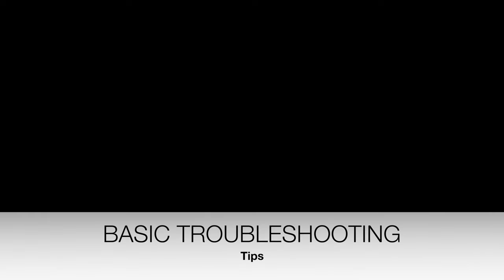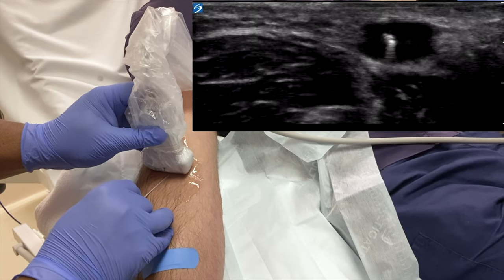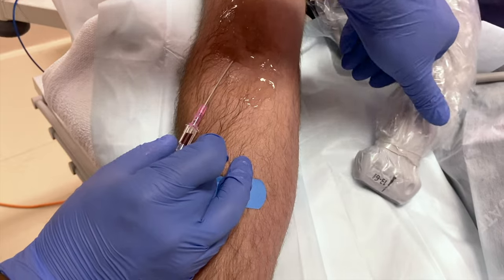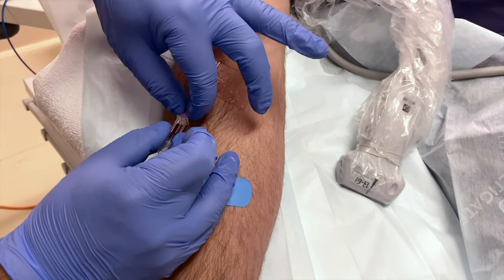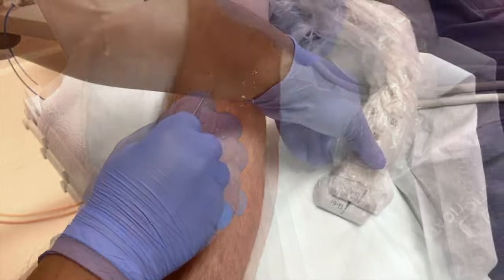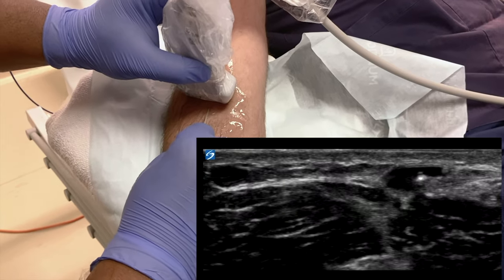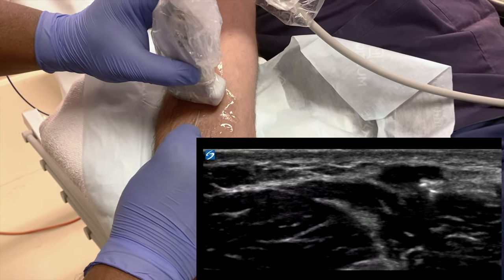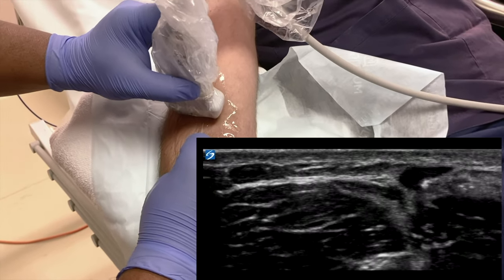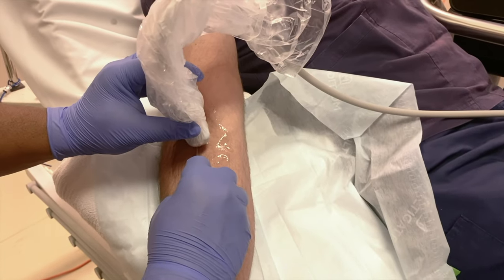Despite good technique, sometimes things don't go as planned. Here is quite a common problem: you have a flashback, yet the cannula will not advance. Pick up the probe and slide it up the arm until you find the needle tip. As suspected, it looks like the needle tip has punctured the far wall of the vein. Fixing this should be quite an easy task.